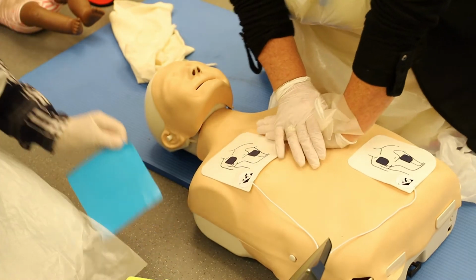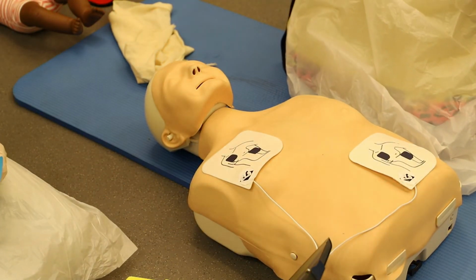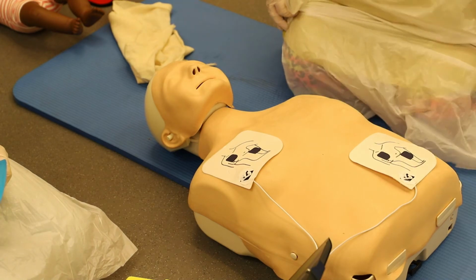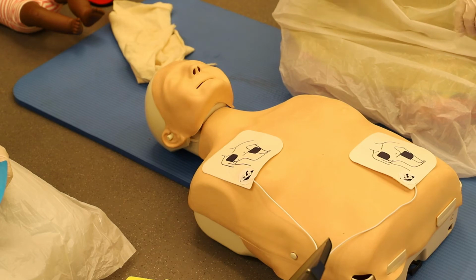Do not touch patient. The machine's told us it is analysing the rhythm. It's checking for a heartbeat. Do not touch patient. They need to make sure that you're not touching. Shock advised. It's telling us to shock.